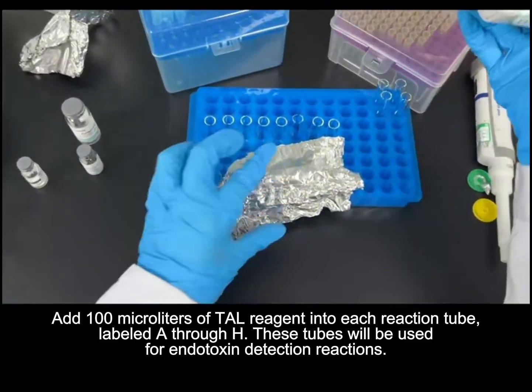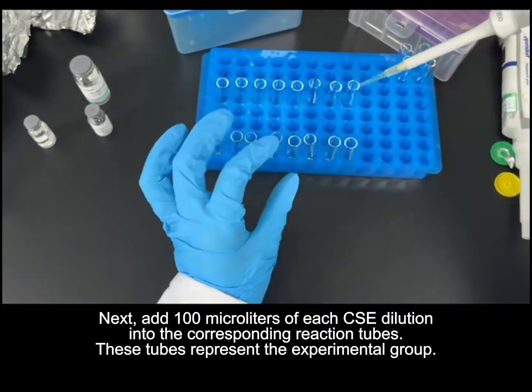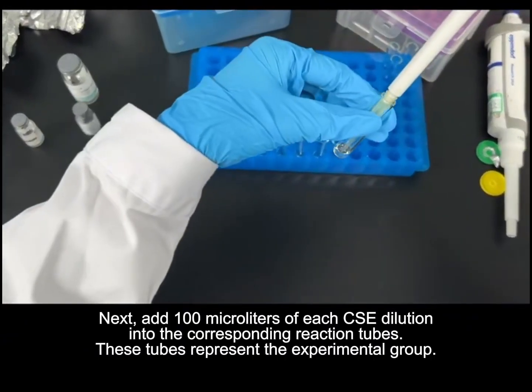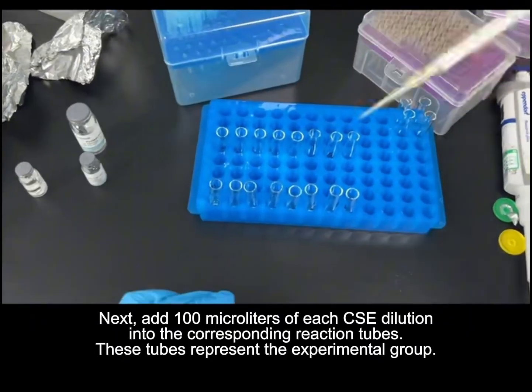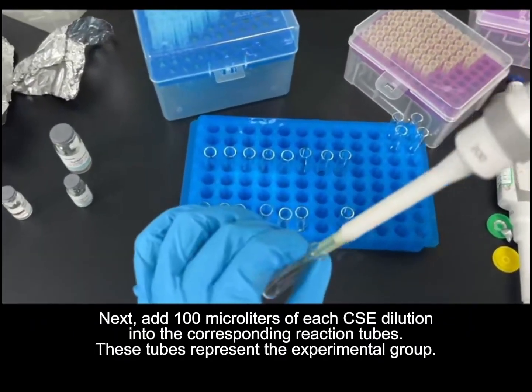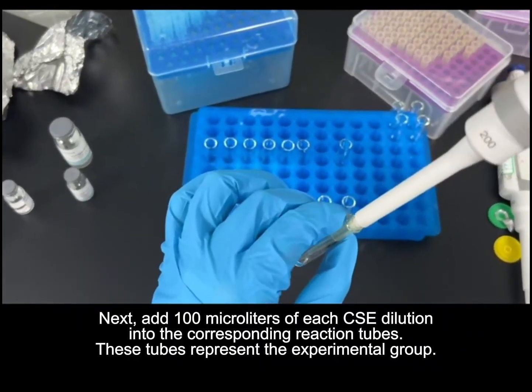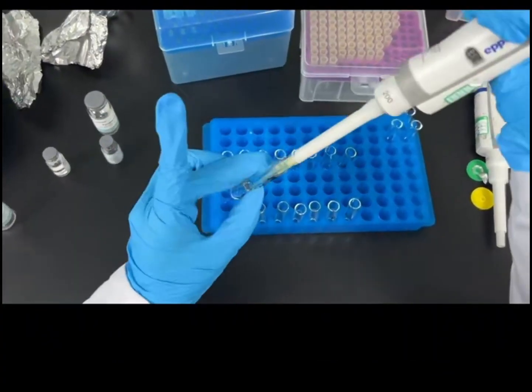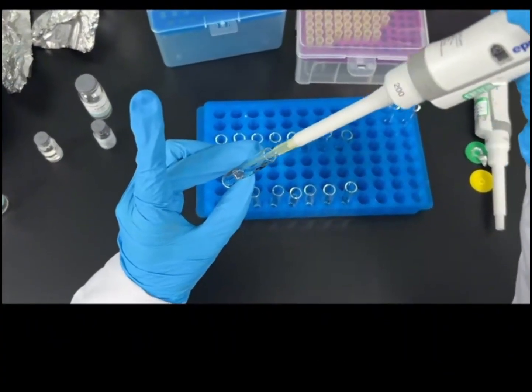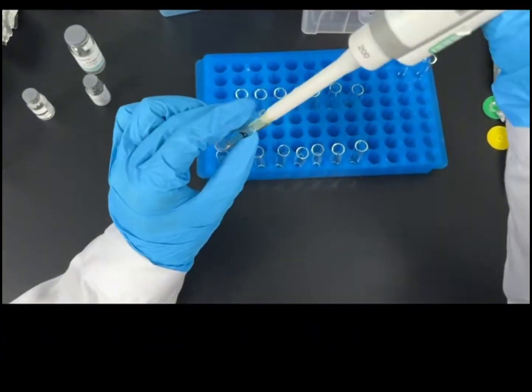Prepare 2 additional tubes as negative controls. Add 100 microliters of TAL reagent and 100 microliters of pyrogen-free water. After adding all reagents, vortex each tube gently for 3 to 5 seconds to ensure the reaction mixture is fully combined.